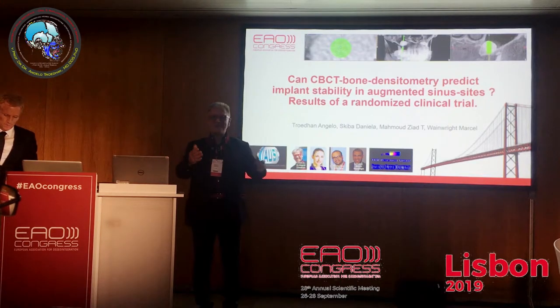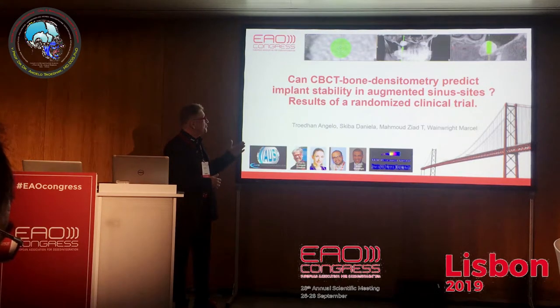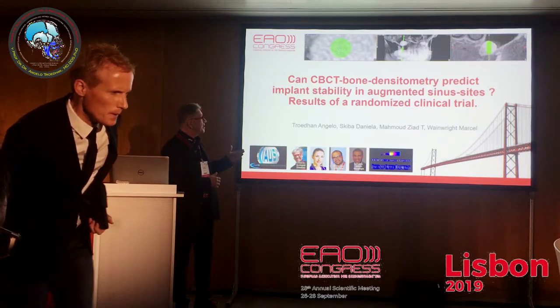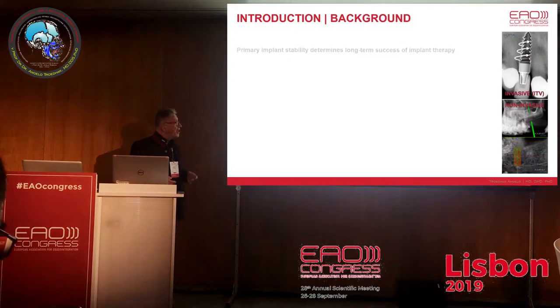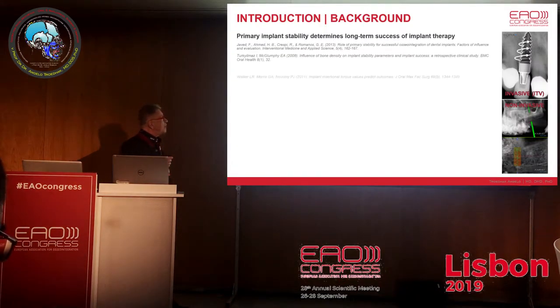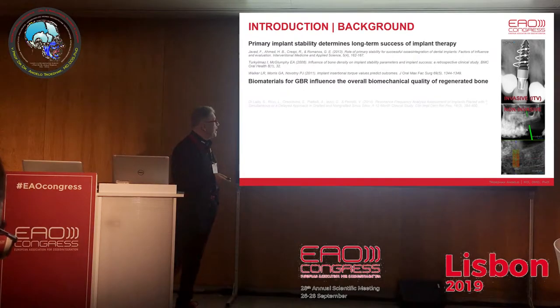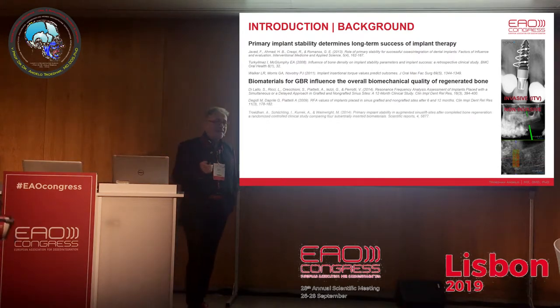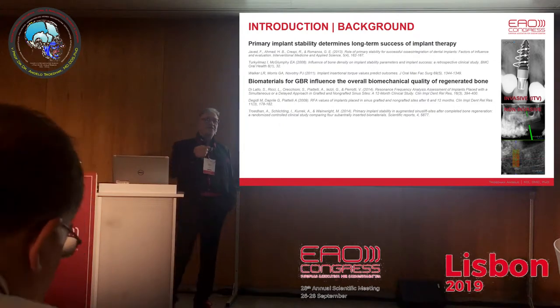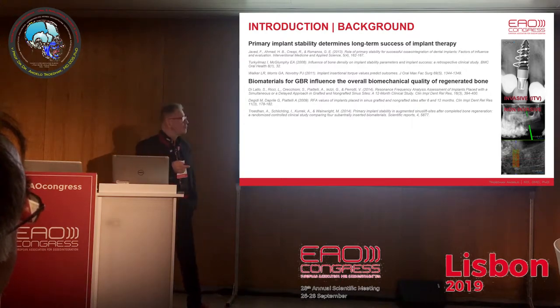Respected chair and judges, respected colleagues, this year I have the great honor to possibly answer the question if CBCT bone densitometry can predict primary implant stability in augmented sinuses. We know beyond any scientific doubt that primary implant stability determines the long-term success of implant therapy, and that biomaterials for guided bone regeneration influence the overall biomechanical quality of regenerated bone. Until now, we were only able to determine the primary implant stability directly during the surgery and not pre-surgically.